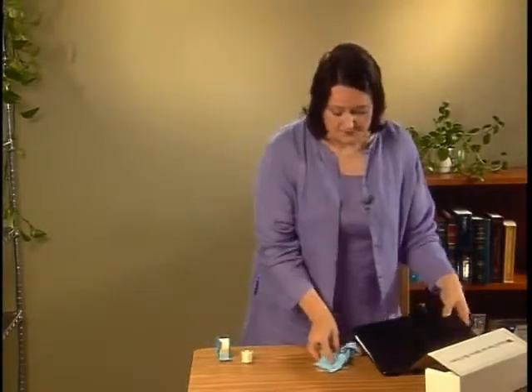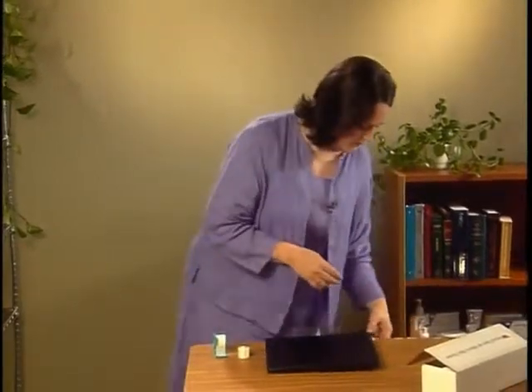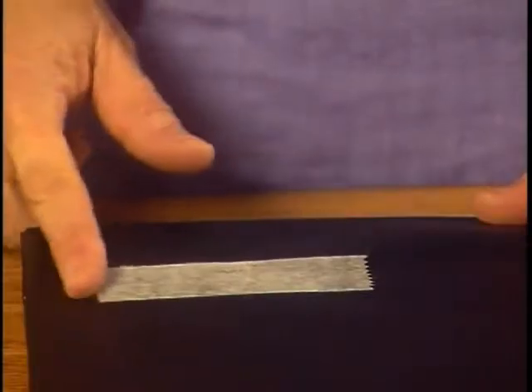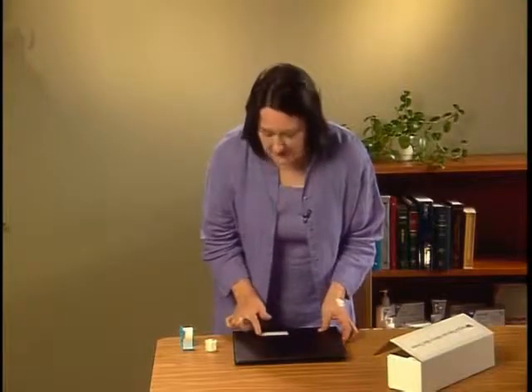Usually, the tackier or stickier the tape, the less pressure you need to apply. Clinicians automatically stroke paper tapes down. Note how the tape becomes more translucent with pressure, but clinicians don't always realize that stroking improves the adhesion of the other tapes as well.